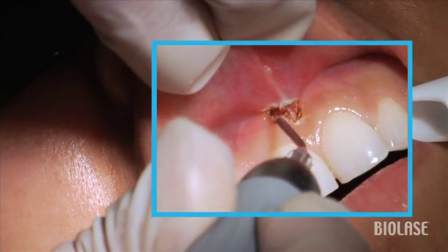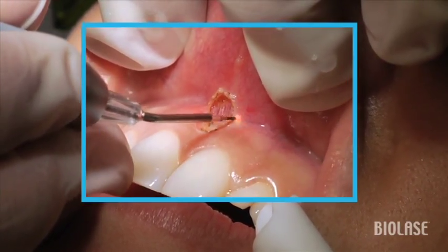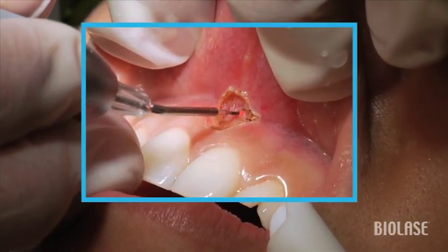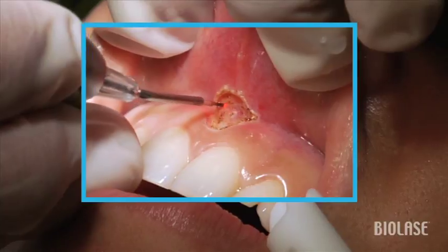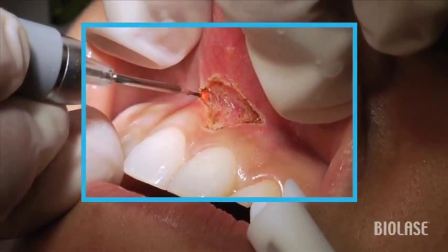Notice how slowly we move the laser tip, because the slower we move, the faster we're going to cut. It removes tissue very gently, and in some cases you're going to see some dark tissue — this is not charred tissue, because this is a very, very vascular area of the mouth, so you're seeing coagulated blood.